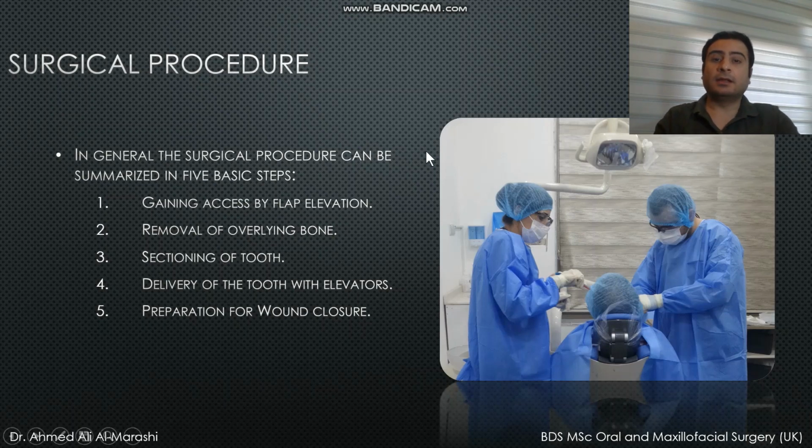Okay? The procedure of third molar surgery is an open surgery, so we open the bone to gain access to the impacted lower third molars. Since we have a surgical procedure that deals with flaps and bone removal, it needs to be sterile.